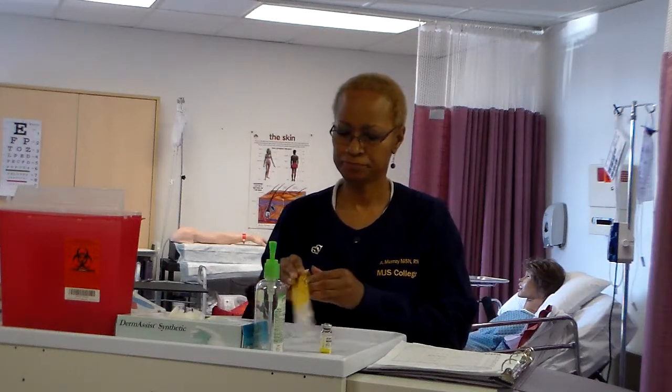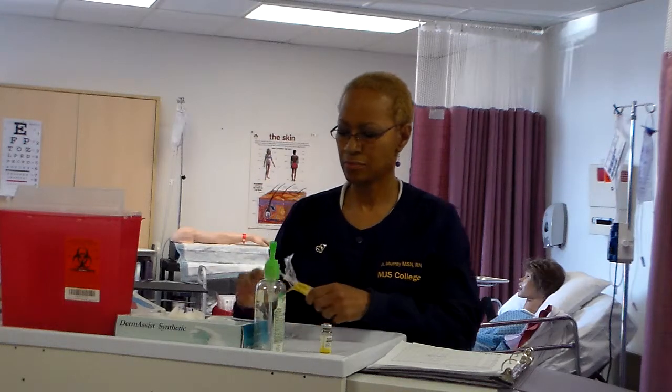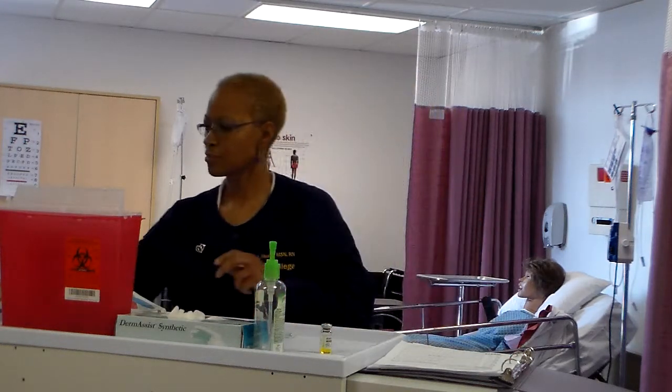Pick up syringe and remove needle cap or cap covering needleless vial access device. Pull back on plunger to draw amount of air into syringe equivalent to volume of medication to be aspirated from vial. Okay, so if according to my order and what I've calculated I have to give 1 ml of medication, then I'm going to pull back only 1 ml of air.